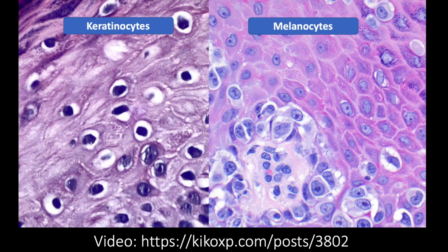All right, now let's talk about melanocytes, which obviously is the pitfall that really concerns people and brings the most angst because it's high risk, and in the litigious environment that we practice in, it's even more worrisome. So let's talk about some melanocyte basics and how to try to stay out of trouble, okay?